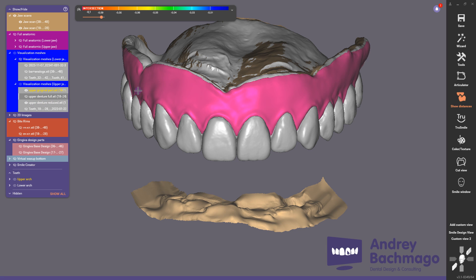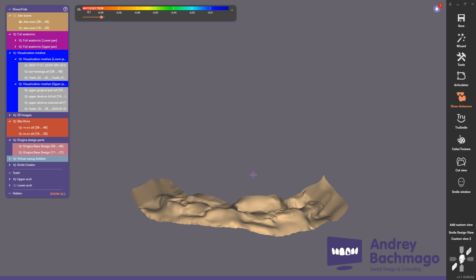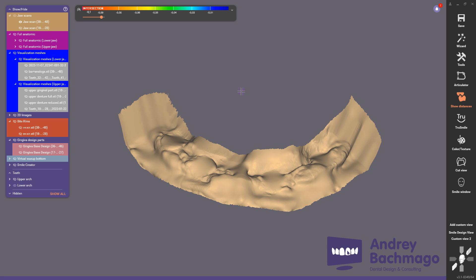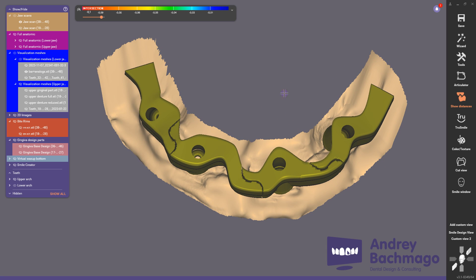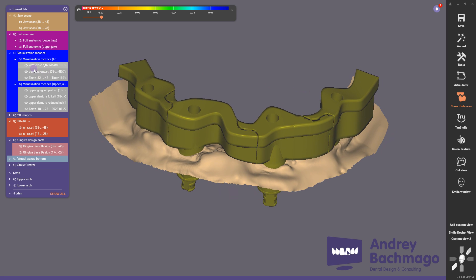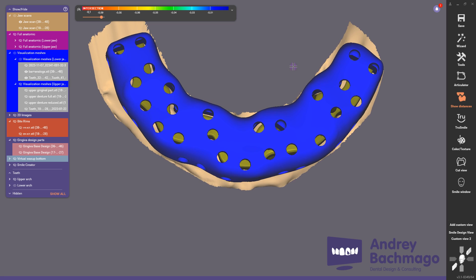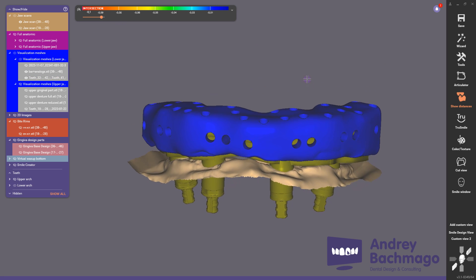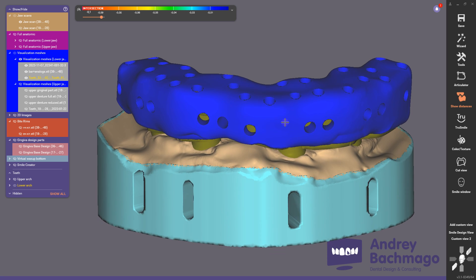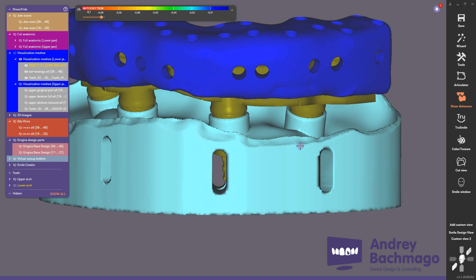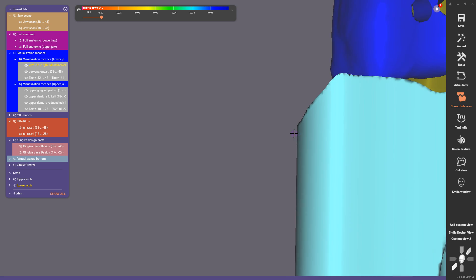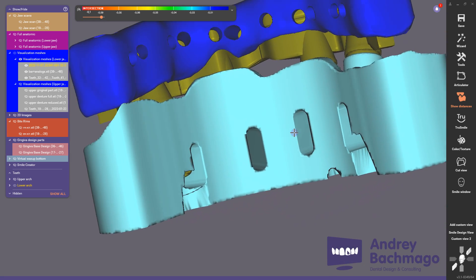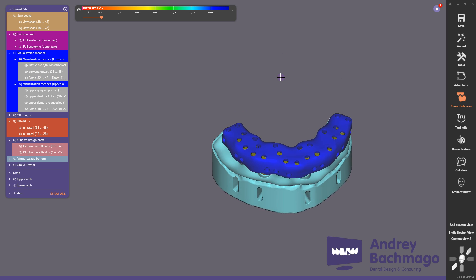On the model we need to create a precise model. For this case I prepared this segmented bar file, which can be connected in the mouth. I prepared a special tray to connect it, and a model where we will place our digital transfer, and after that we will scan the scan bodies on this model.